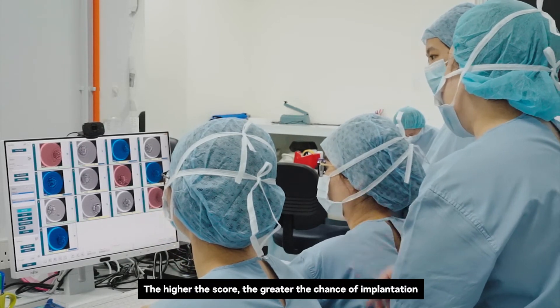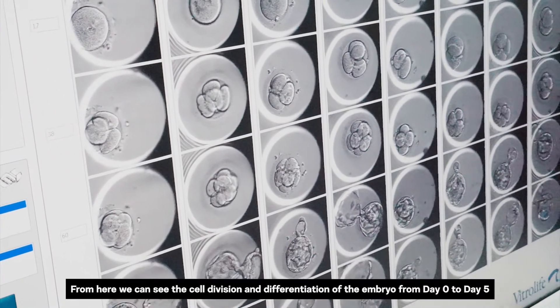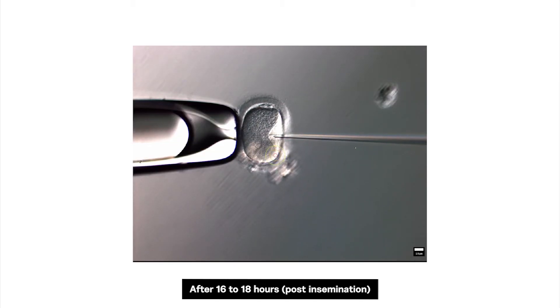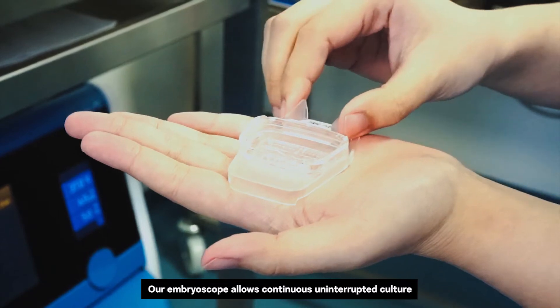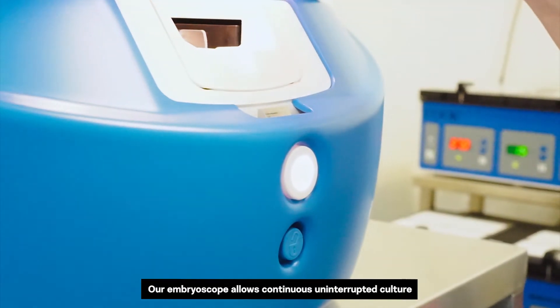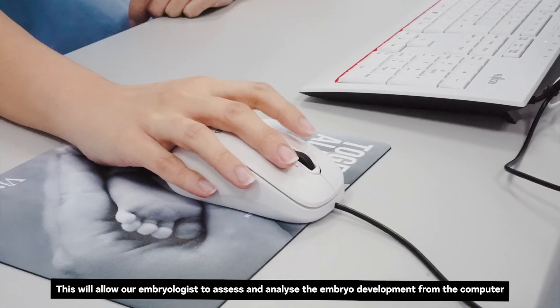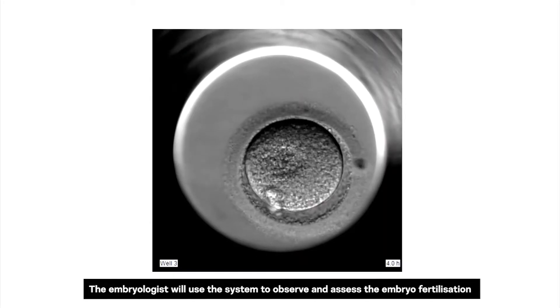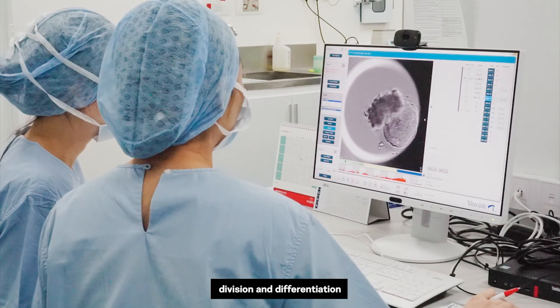The higher the score, the greater the chance of implantation. From here, we can see the cell division and differentiation of the embryo from day 0 to day 5. After 16 to 18 hours post-insemination, evidence of fertilization is checked without disturbing the embryo incubation process. Our Embroscope allows continuous uninterrupted culture by capturing snapshots every 10 minutes to create a time-lapse. This allows our embryologists to assess and analyse embryo development from the computer, observing fertilization, division and differentiation.